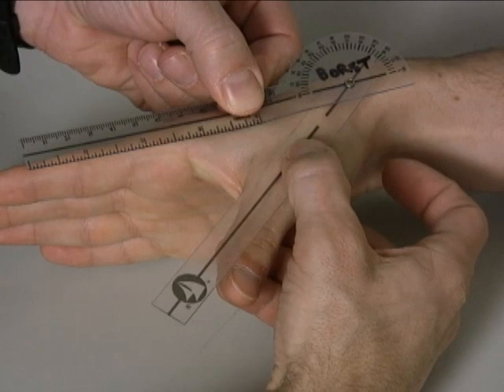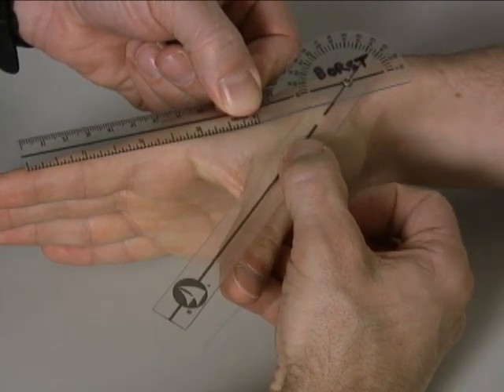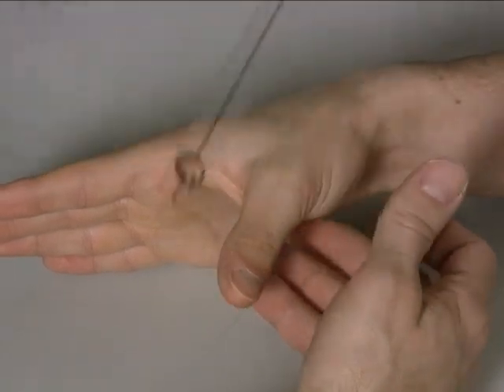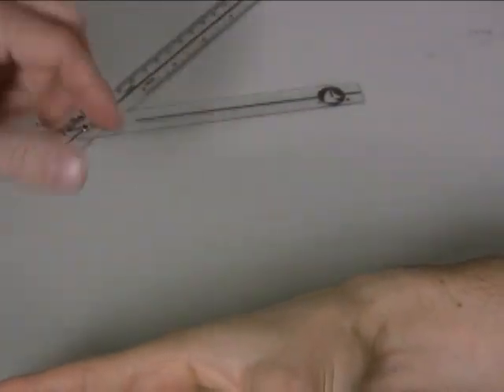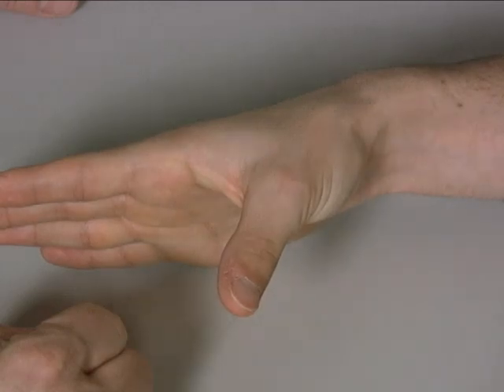In palmar abduction, that tends to fall about at the scapho-trapezial joint. In this case, I moved a little. There we go. We have about 40 degrees of palmar abduction at the thumb carpometacarpal joint.